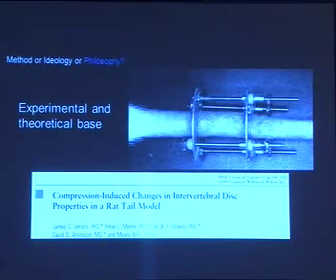And as an experimental and theoretical base, Ilizarov frames and Ilizarov principles are a very handy tool in research. You can widely use the Ilizarov approach and techniques in all kinds of experiments when you need to control bone formation. It's very easy.